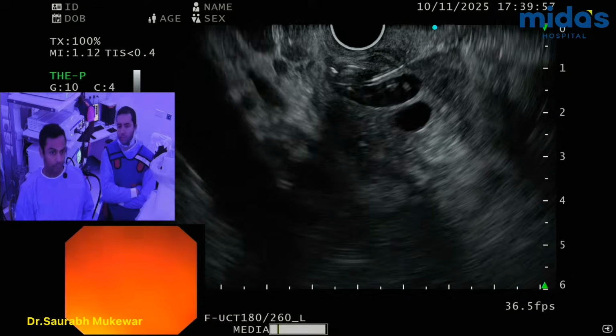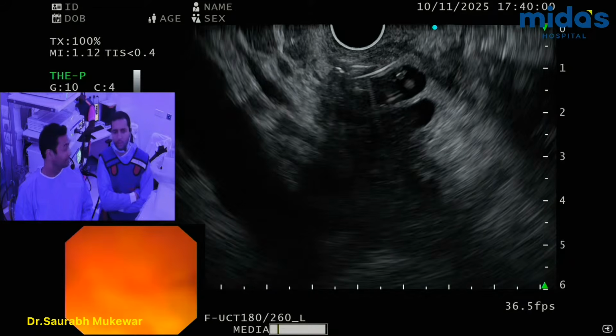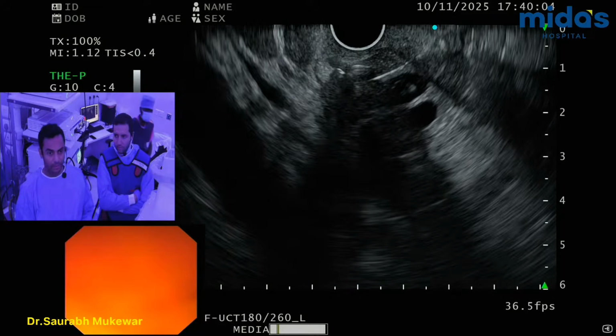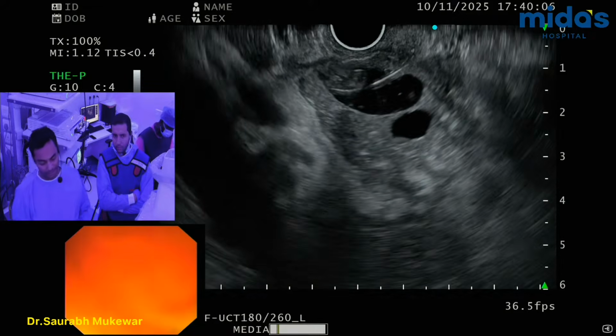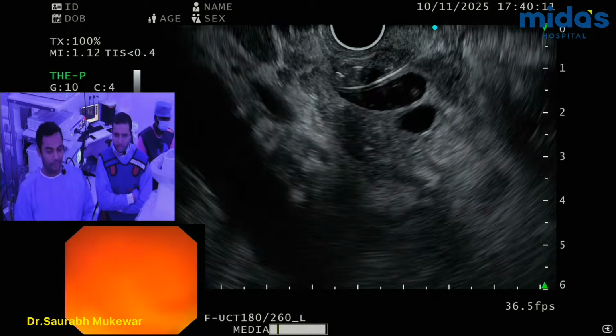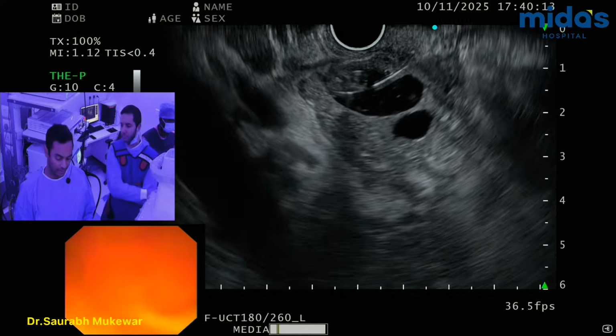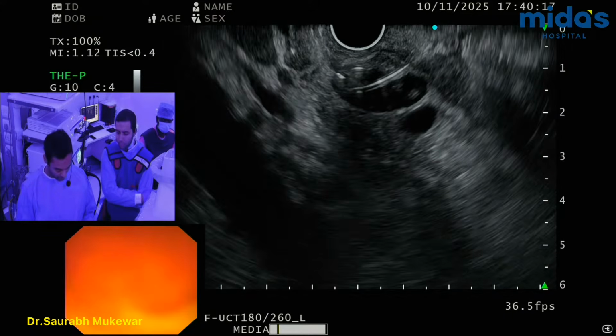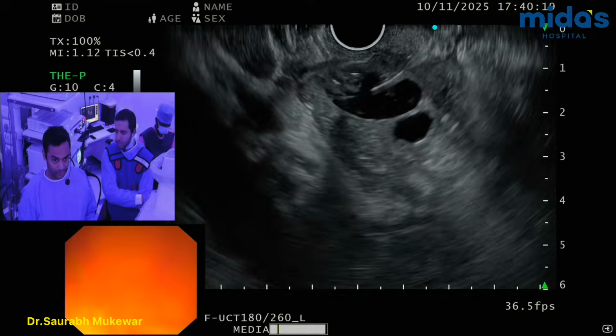And when do you decide to switch from CDS to hepatico? Well, obviously, if there's a big vessel or it's not feasible, but 95% of the time I can do it. Now, I do hepatico-gastros only when, listen, man, I have to target the left hepatic duct. Like last week, we had to do a specifically left hepatic duct, so we did it.